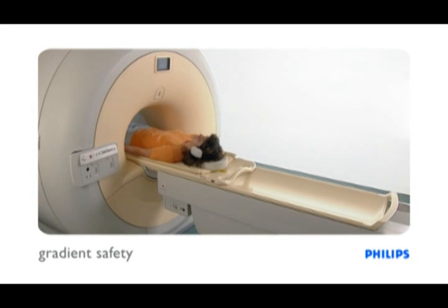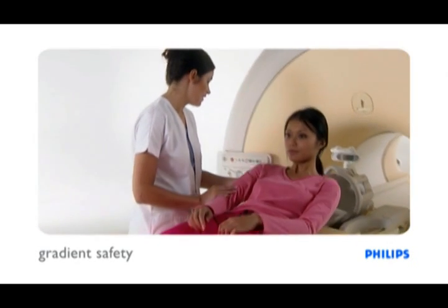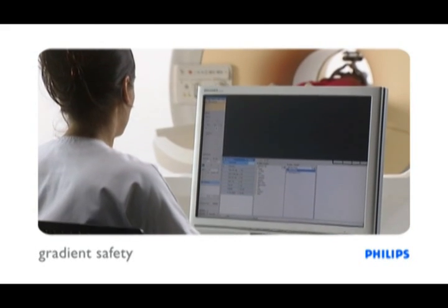However, in common with the static magnetic field and the RF field, the gradient magnetic field system requires certain safety precautions.